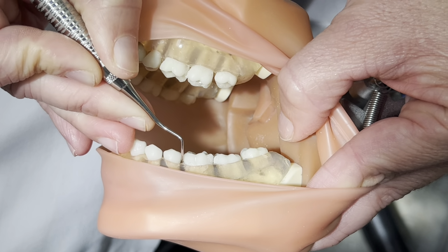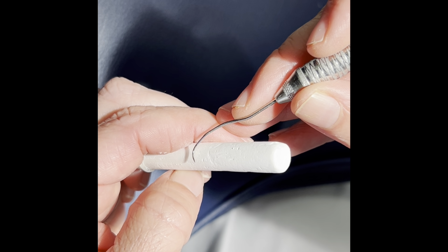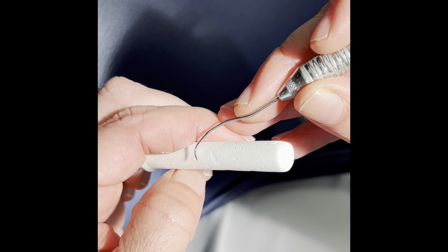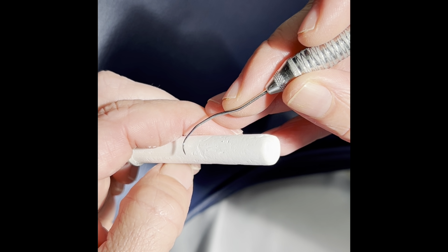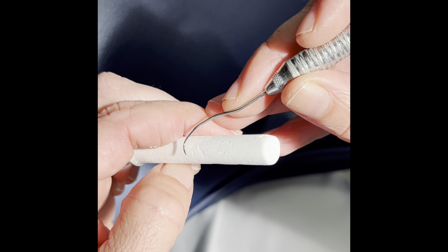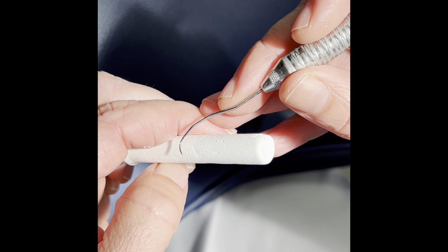The next part of the lab activity has you use a piece of chalk and demonstrate an assessment stroke, a calculus removal stroke, and a root debridement stroke. The first stroke that I'll demonstrate is the assessment stroke using your 11-12 Explorer. When you apply an assessment stroke correctly, very little or no chalk should be removed.